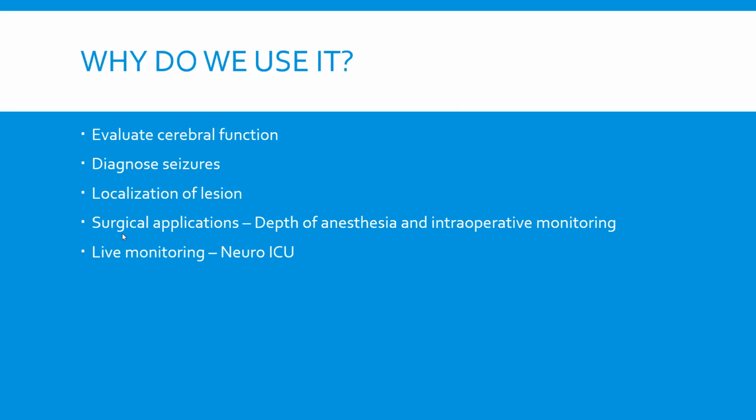This is just for your information. Sometimes the EEG can also help us with surgery. Depending on how sedated a person is during anesthesia, the EEG can be very slow or totally flat. So anyway, there are some surgical applications of EEG.